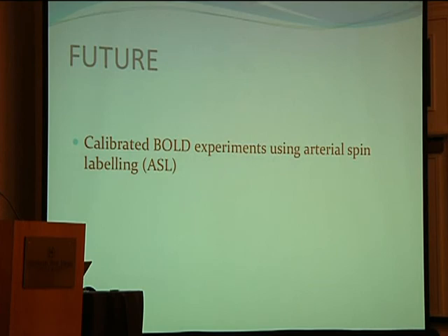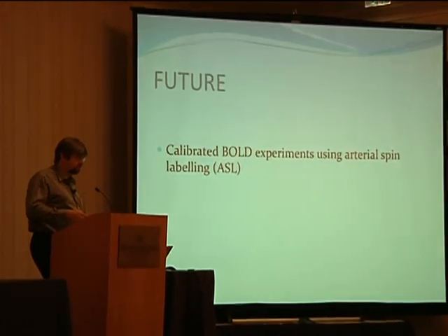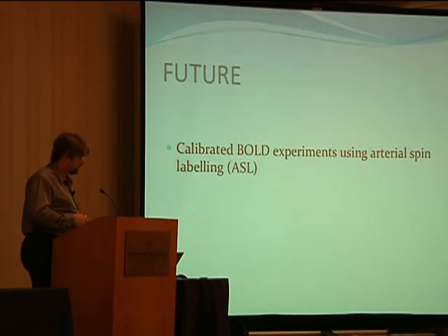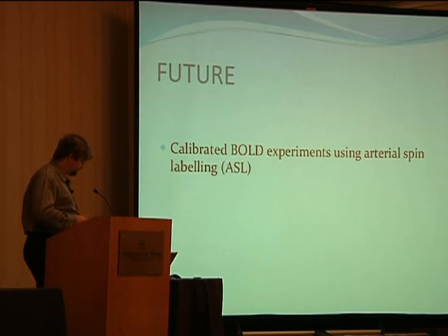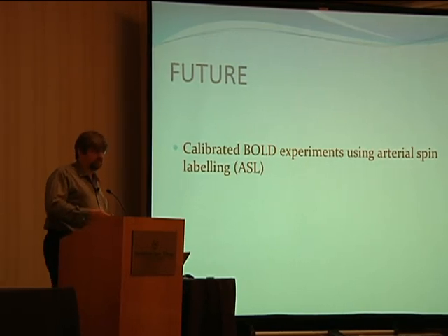So again, these experiments were tapping only into BOLD contrast. Essentially, this contrast is a complex function of both neural activity and blood flow. So what was needed is to disentangle the neural contribution and the blood flow contribution, and we should use a method, arterial spin labeling, which allows functional imaging. It can be used just like BOLD to measure functional responses in cortex and cortical gray matter, and would allow us to disentangle neural and vascular contributions.